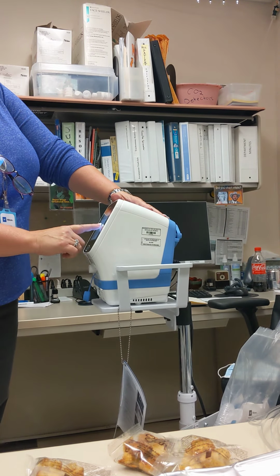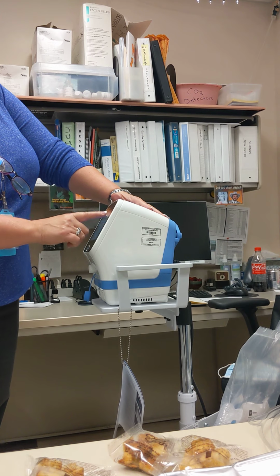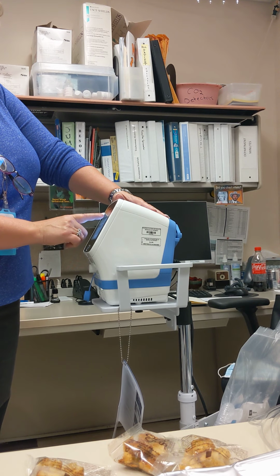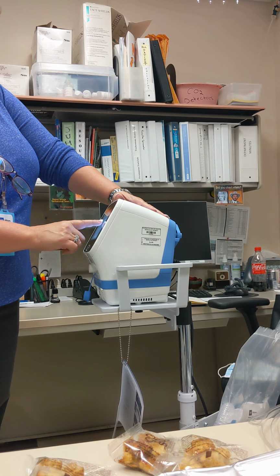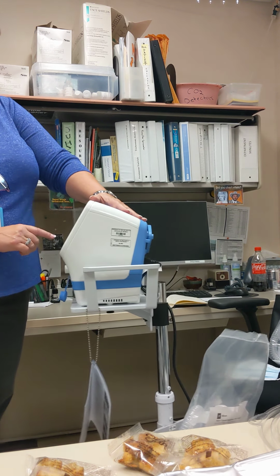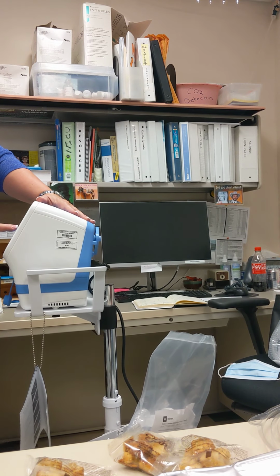Shannon, were you there with me with that blasto patient when we were trying it on Osvaldo? No, I was not. So we put him in pressure control on the vent. He was really, really critical, but I wasn't even getting a chest rise out of him, and sats dropped. I was not getting a tidal volume, I was not getting anything. Yeah, because you're only supposed to use it in manual mode.